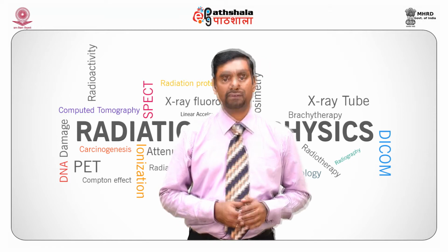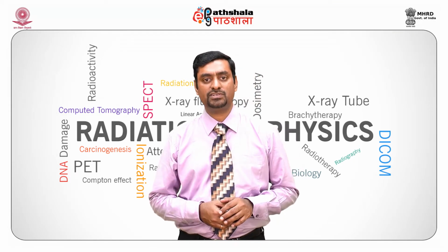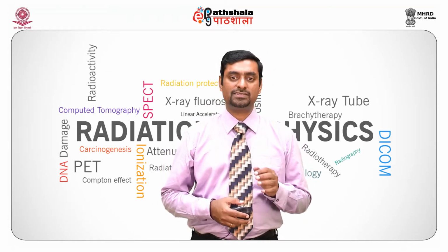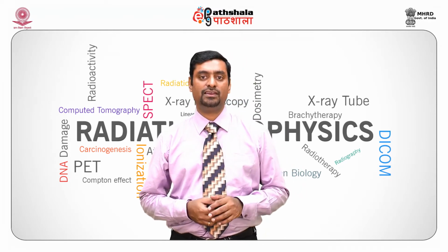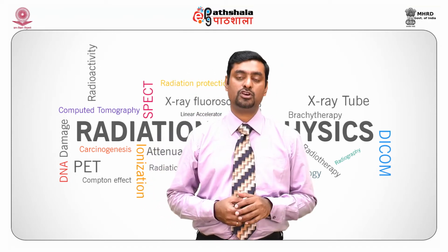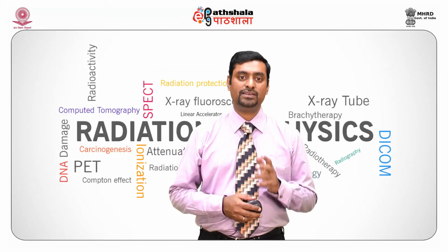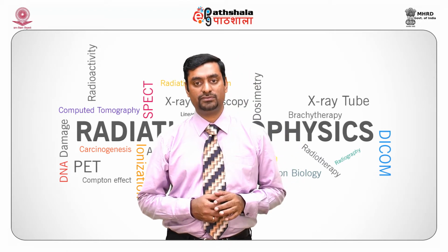Let us move on slowly towards the film screen receptor. Generally, single-sided emulsion coated films are used for mammography purposes. The cassettes that are used for mammography have a single-sided intensifying screen with an absorptive base. The films can be identified with a notch on the right hand side of the film, as seen in this illustration. The advantage of the film screen receptor is that it has high spatial resolution.